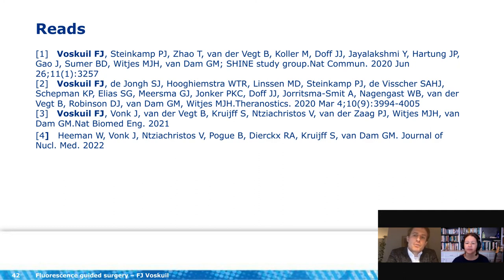But there are upcoming new techniques. I don't know if you're familiar with it, but the MSOT system developed by the group of Vasilis Ntziachristos, which is using sound, ultrasound wavelength, to generate deeper tissue penetration. So the laser is emitting wavelength, and the vibrations are detected by ultrasound, and it's reported that you can image up to one centimeter. So that's really interesting. If you're interested in that, look for some papers of that group.